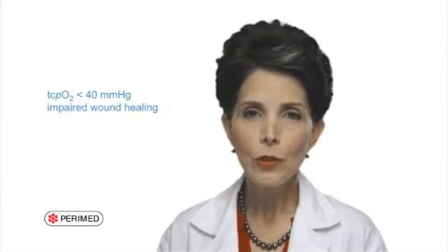Values in healthy people are usually a bit lower on the foot than they are on the leg. 38 studies since 1982 suggest that hypoxia sufficient to impair or prevent wound healing is defined as a TCPO2 less than 40 millimeters of mercury. So TCPO2 values obtained while breathing normobaric air can be used to predict which wounds will not heal spontaneously.